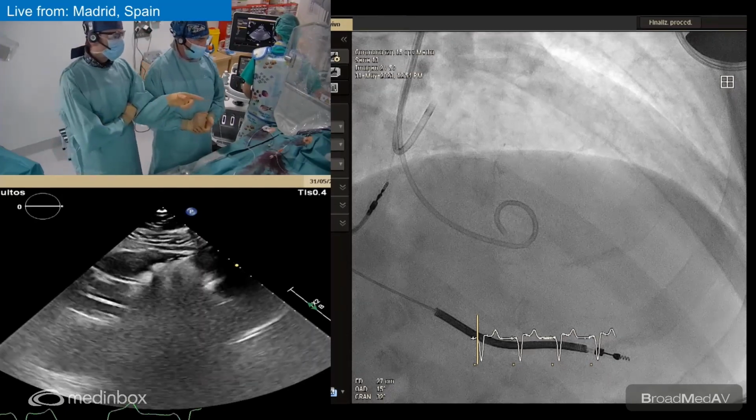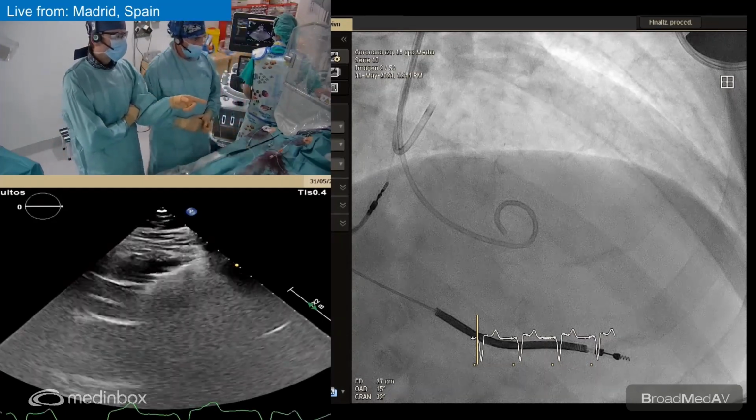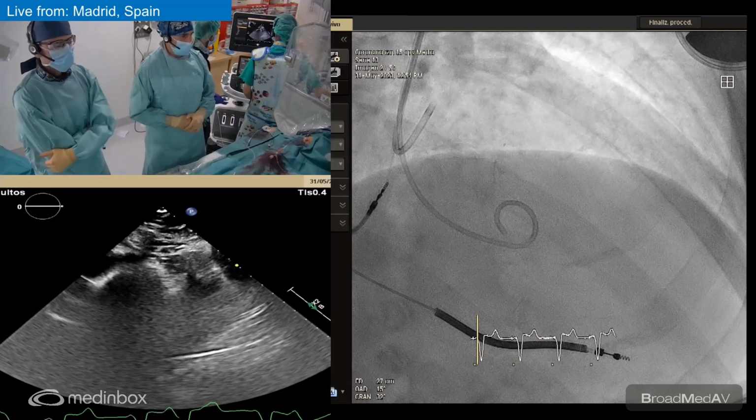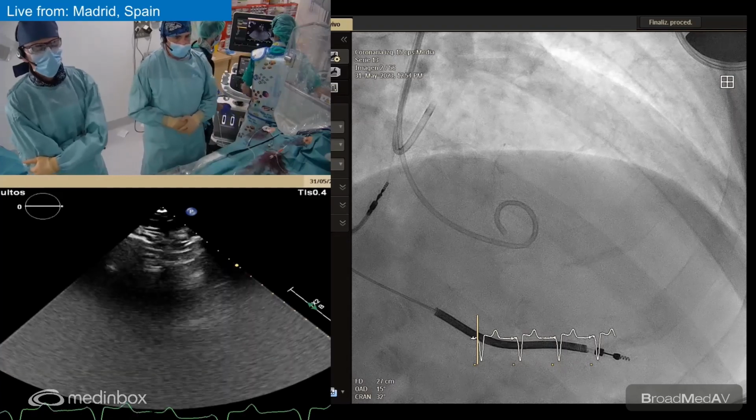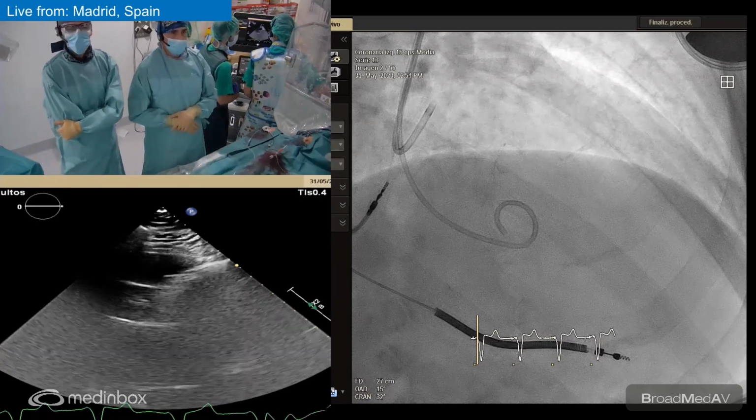We're waiting 5 minutes more or so. Theoretically, 32 was the beginning. We have 4 minutes.